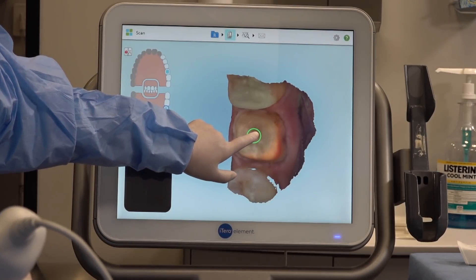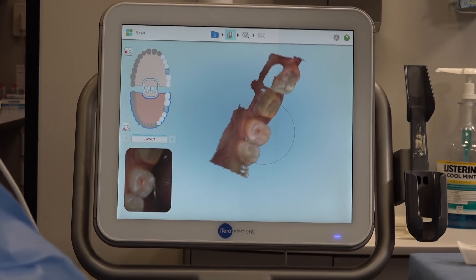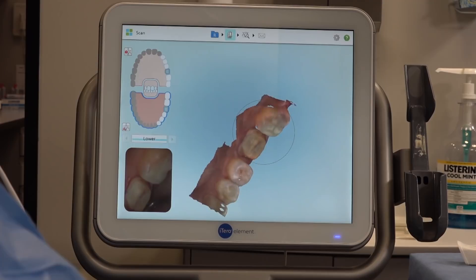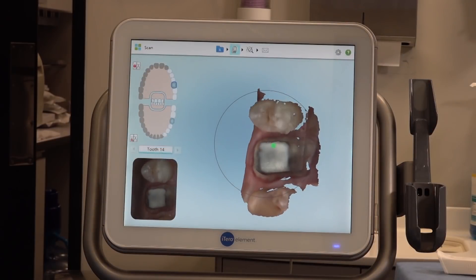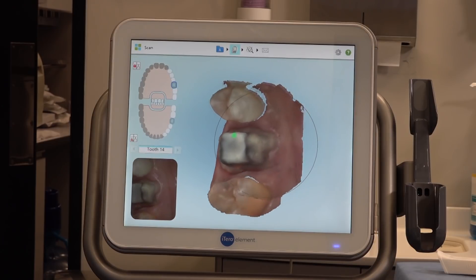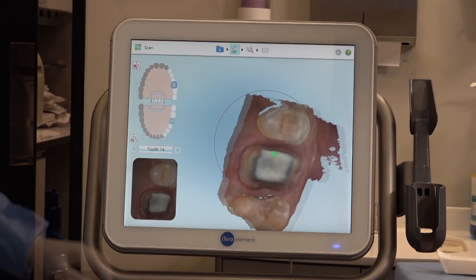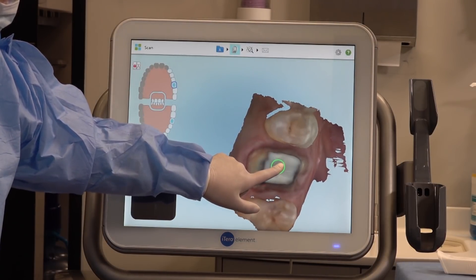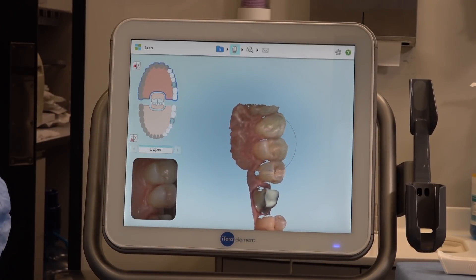We'll repeat the same on the upper molar with a high-res scan of the prep, followed by the rest of the quadrant. As I sweep the scanner along the occlusal, buccal, and lingual, I watch the screen as the system continuously builds the digital model and will deactivate the camera once I determine enough of the quadrant is captured. It's really important to ensure the contact surfaces of the adjacent teeth are captured in these scans.